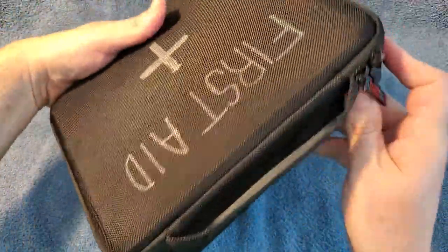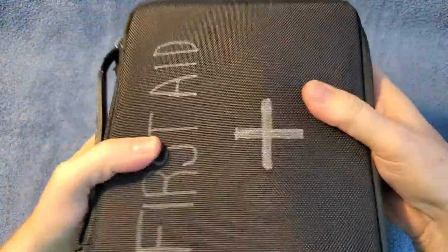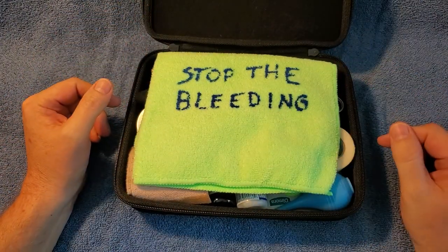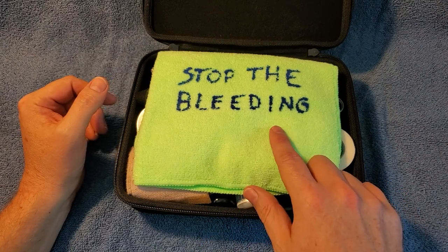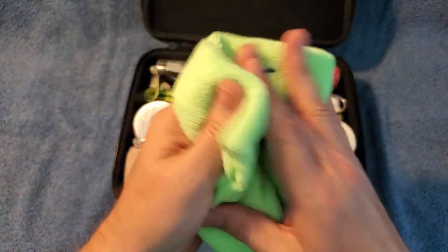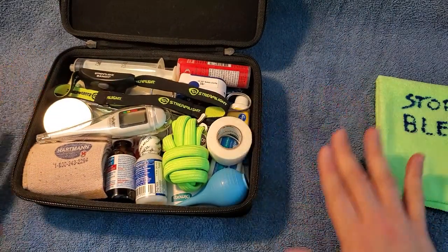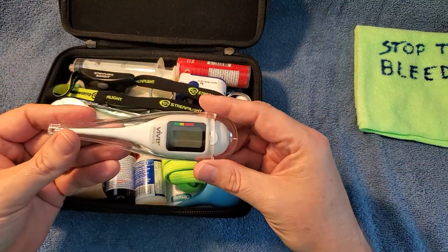Let's open it up. I like this box because it's one of those sturdy boxes — you can't really squish it. This is about the right size for me. The first thing you see here is stop the bleeding, because usually what kills people really quick is if you have an artery or something like that bleeding out. Grab this and shove it in there as quick as you can to stop the bleeding. I'm not going to go through this in any particular order because it's all just kind of crammed in there anyway.